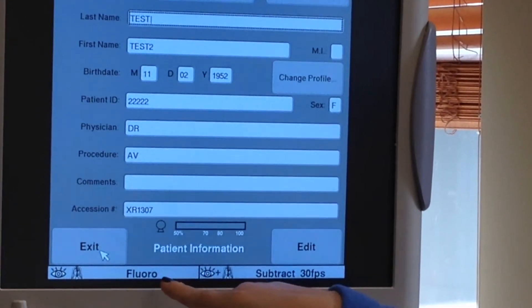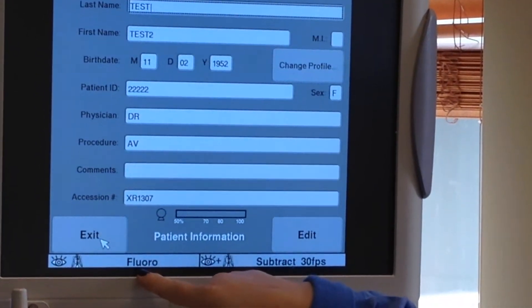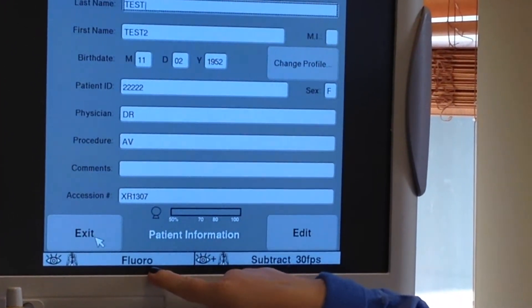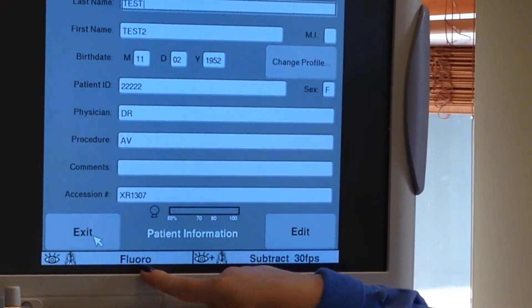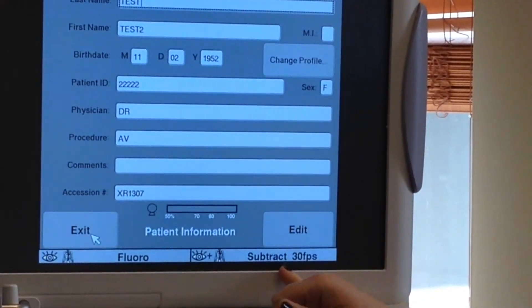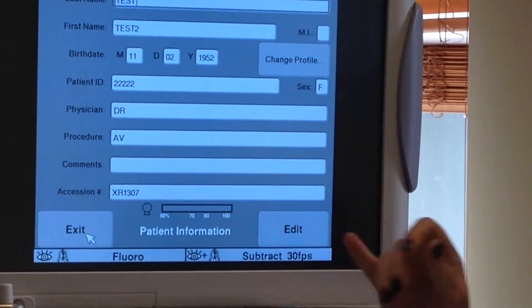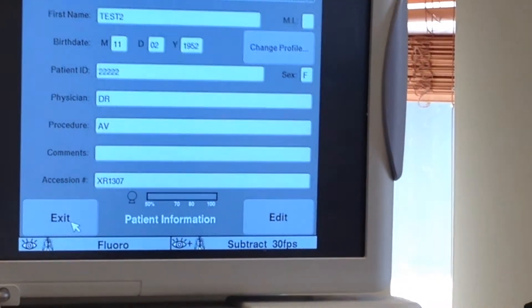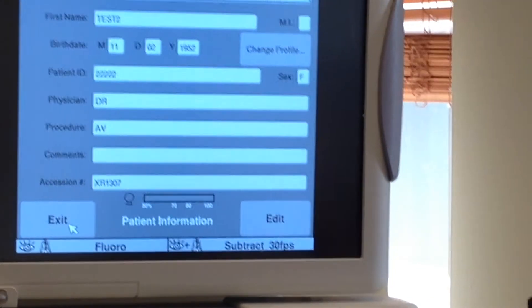Now we are at the bottom of the page, we are going to see fluoro and subtraction. Fluoro is the eye button and subtraction is the eye plus button.